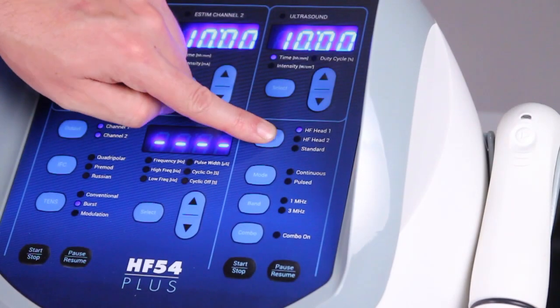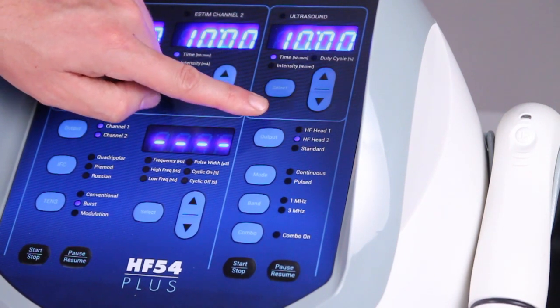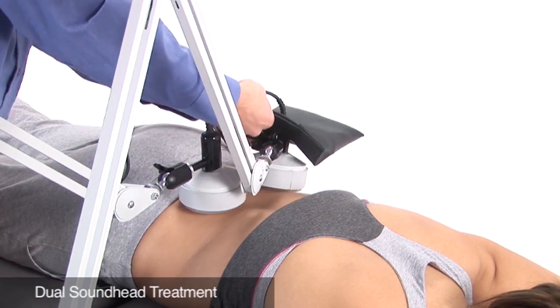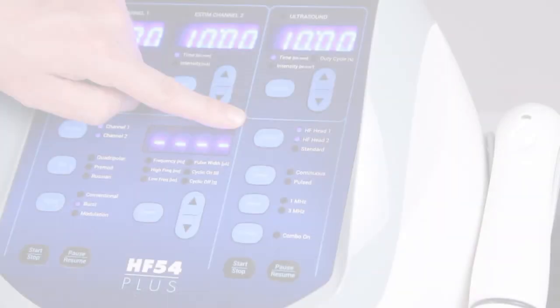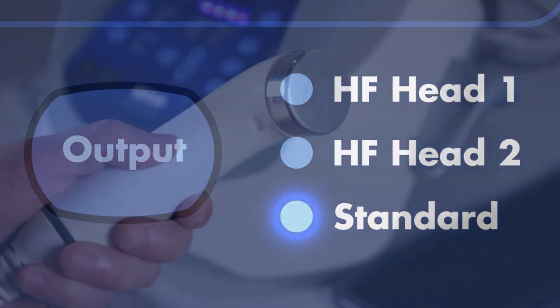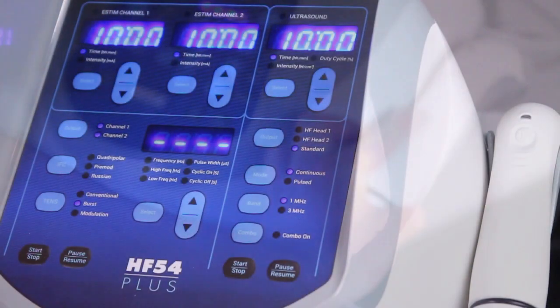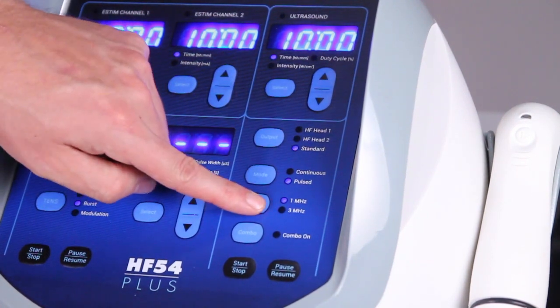To treat with two sound heads simultaneously, press the output button twice until both sound heads are selected. In this mode, all settings will be shared by both sound heads. Press the output button again to select standard for ultrasound using the optional handheld applicator. Select either continuous or pulsed mode at one or three megahertz settings.